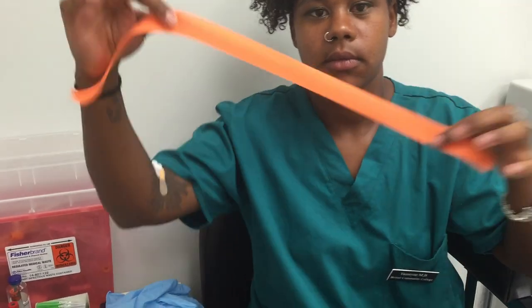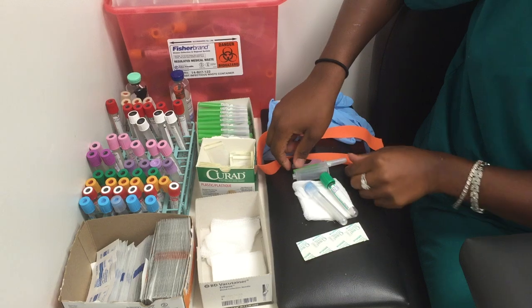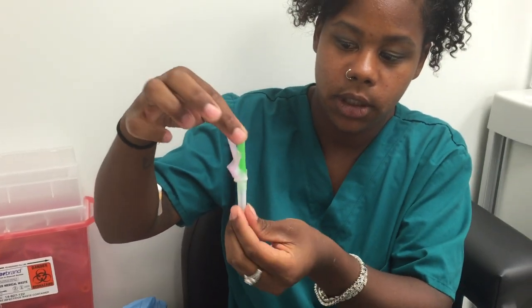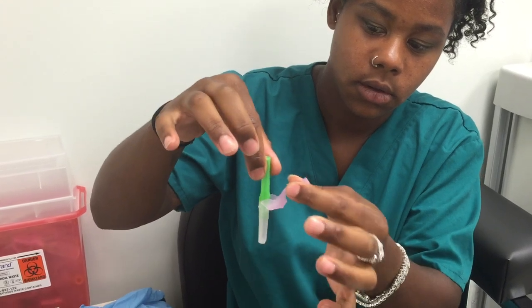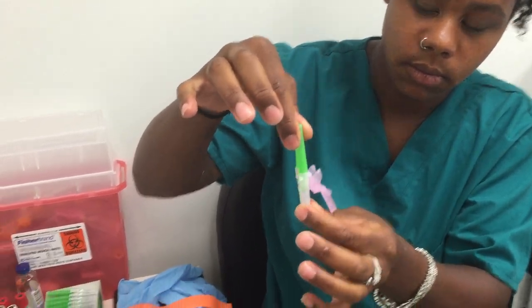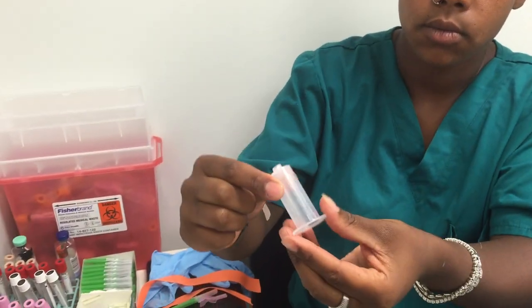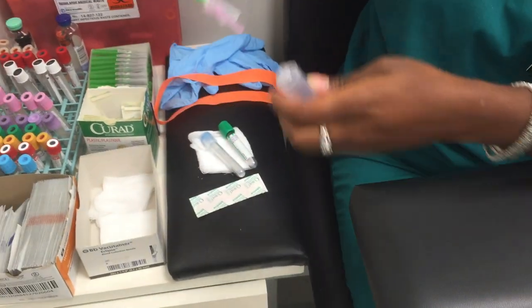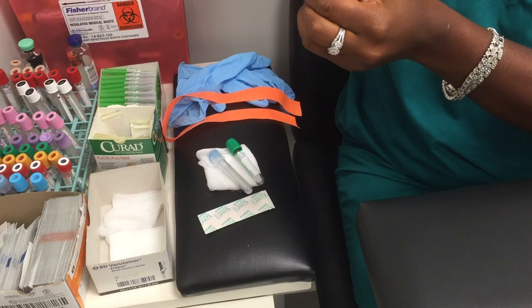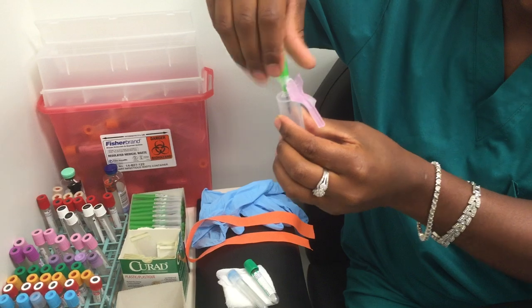Another thing we're going to use is a tourniquet. This is your typical needle — make sure the needle has a safety device. This is a tube holder, so this is what you will be attaching to your needle. You will demonstrate how to do that — just twist it on.